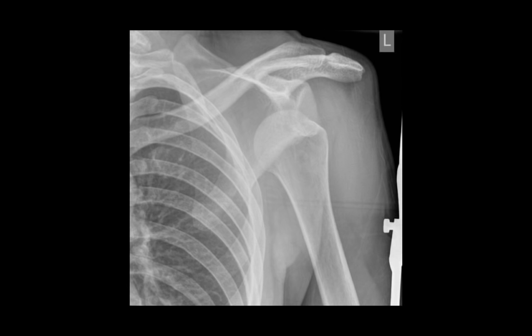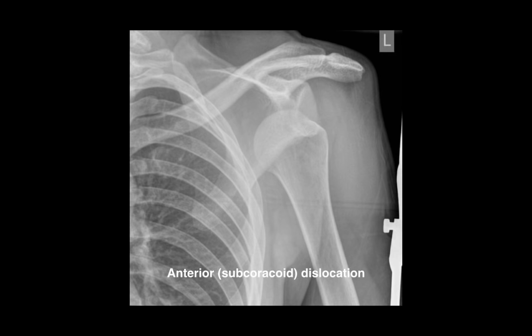This is a dislocated shoulder. We can see the head of the humerus is outside of the glenoid fossa, and it's lying underneath the coracoid process, which projects anteriorly. Therefore, this is an anterior dislocation, also known in this case as a subcoracoid dislocation.